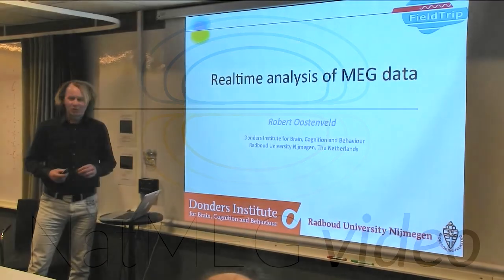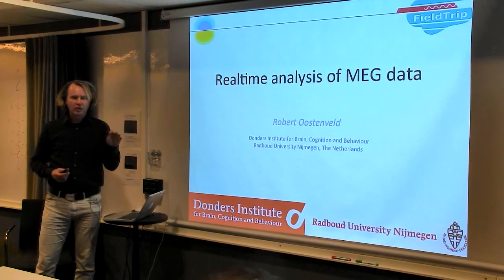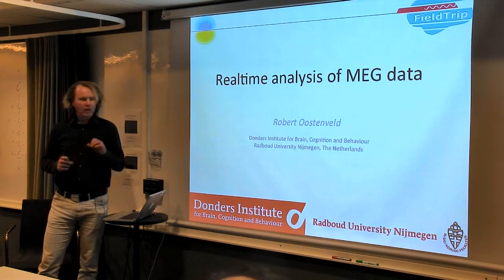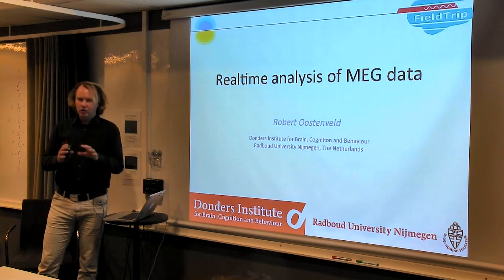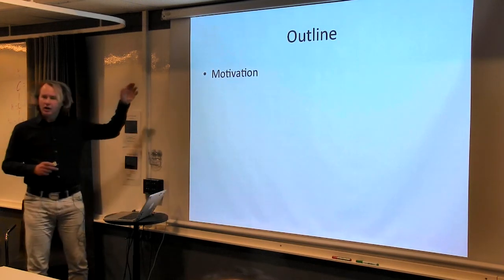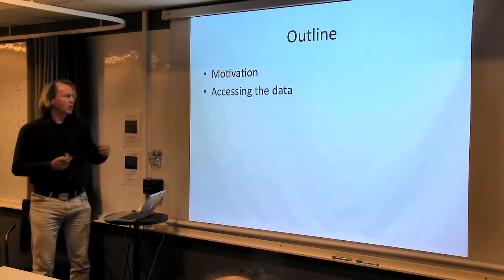Okay, good. So this talk is about real-time analysis of MEG data. And what I'll do is cover various topics that have to do with real-time data analysis. I'm going to explain general topics. Actually, let me switch to the outline slides. So I'll show the motivations: why would you want to do real-time analysis?